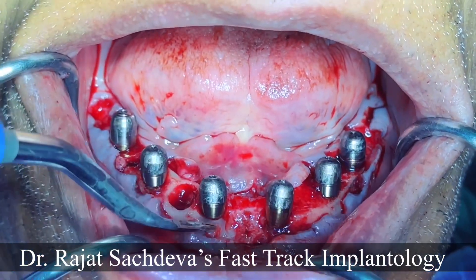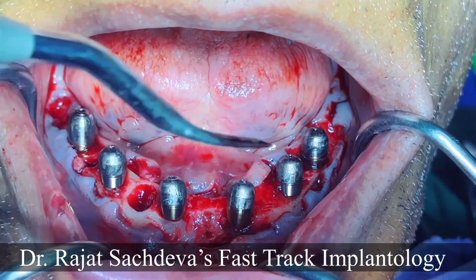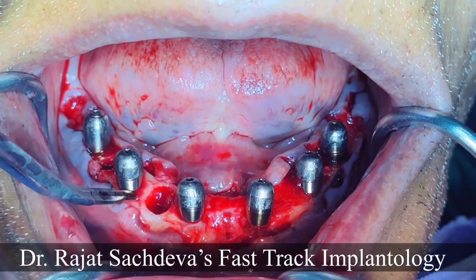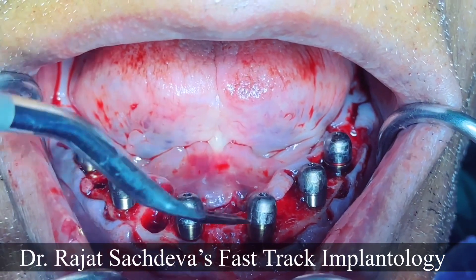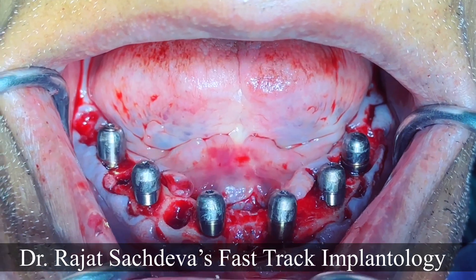After that we will take impressions, jaw relation, and the next day do a teeth setting trial, and the following day we will deliver to the patient. You can see that the angulation is spot-on. All implants are parallel, and you can see the AP spread. All implants are placed on a level — in the central, canine, and molar positions. And you get good results. Thanks.